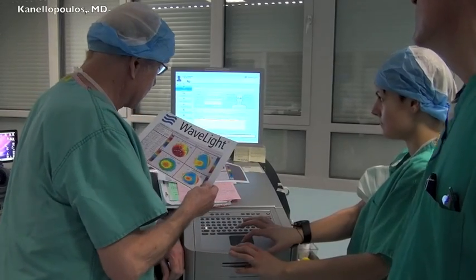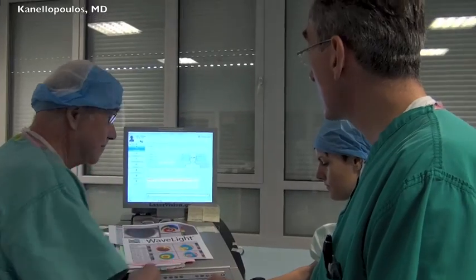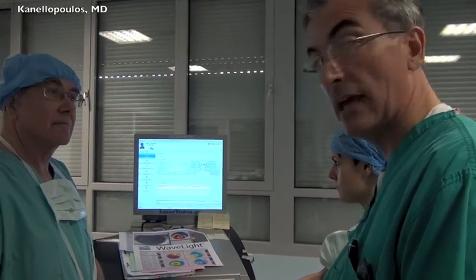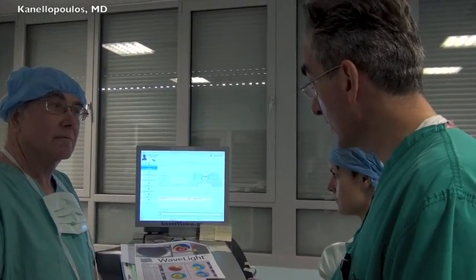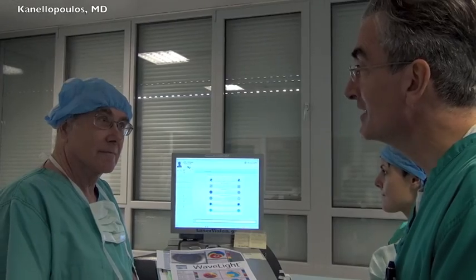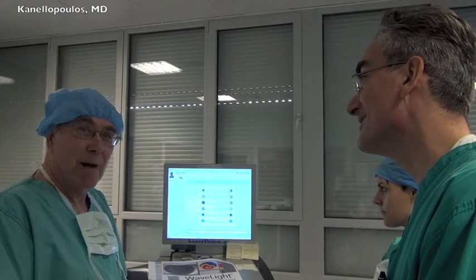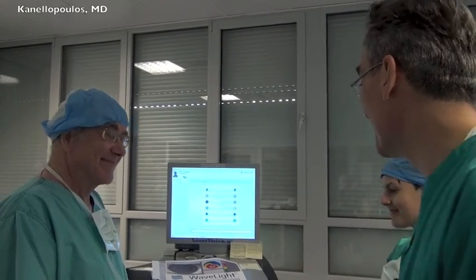All right, this is a big day for us. We're going to show you and try and design an Athens Protocol case, but that's not the highlight of the day. The highlight of the day is we have George Waring III here in Athens. He's visiting for a meeting. He was kind enough to stop by and see how we try and normalize keratoconus. My pleasure. Thank you, George.